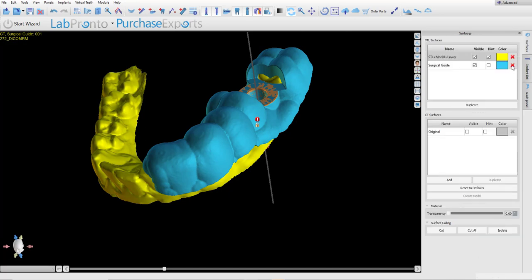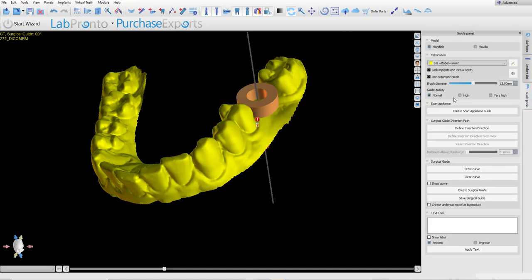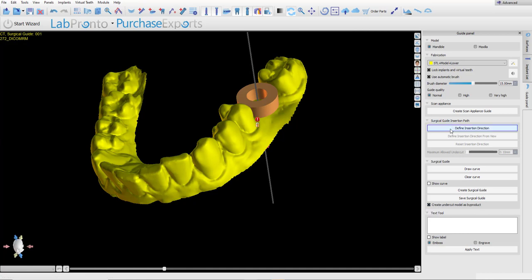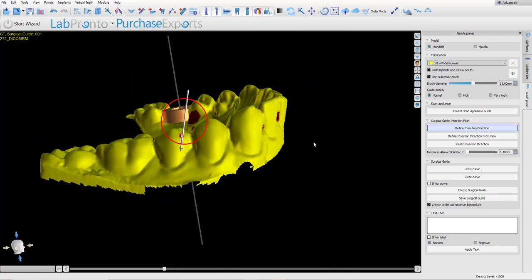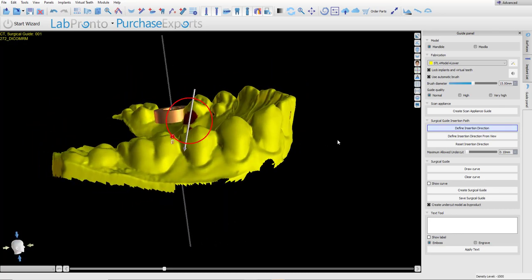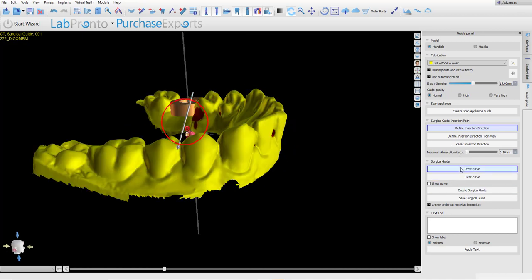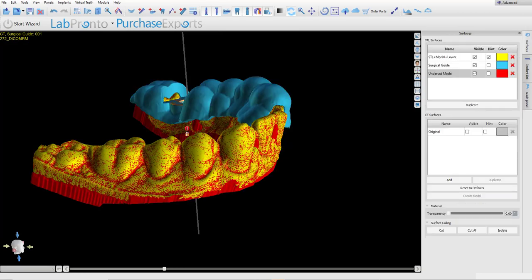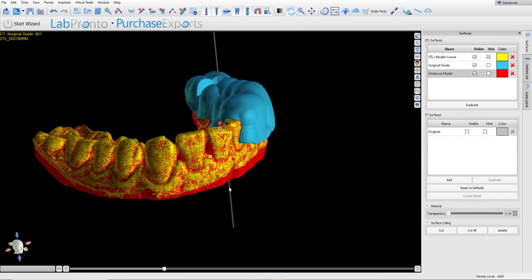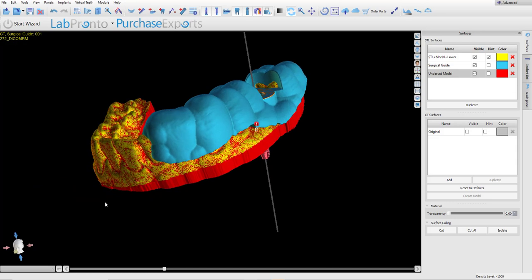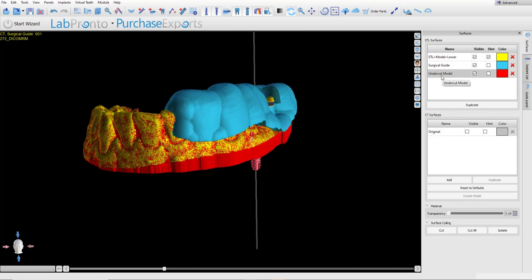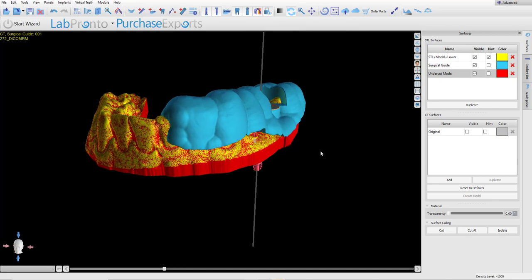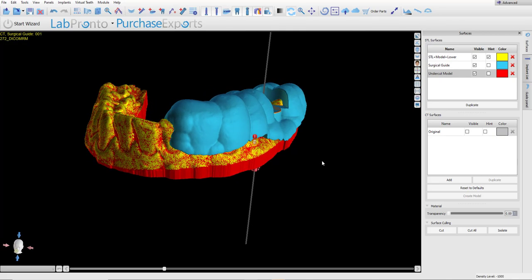Let's go ahead and delete the surgical guide and let's repeat the process. With the checkbox Create undercut model as byproduct, you could click Define insertion direction, update the desired path of insertion, and then click Draw Curve. Create surgical guide. And what we could see here is that the software created the surgical guide and we have the original STL model and we have an additional model created by the software that's visible in the surfaces panel, which is the undercut model and that is the model with the undercuts removed.